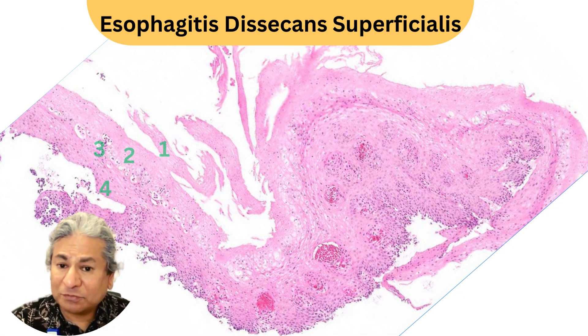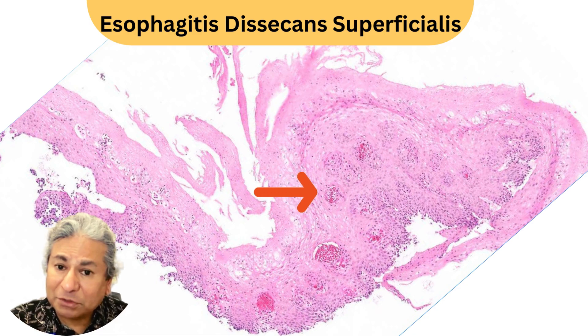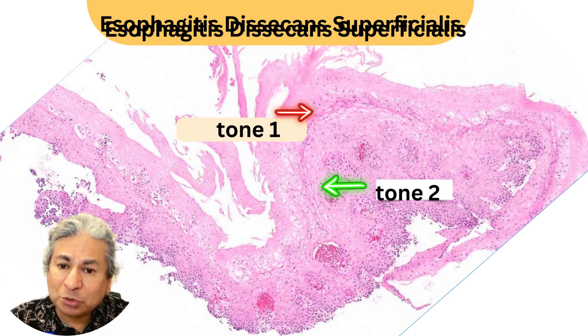On the left side you see those four layers, but on the right side you don't. What you do see is that two-toned appearance — two distinct colors, one up and one down.